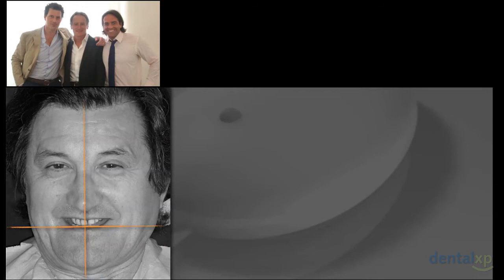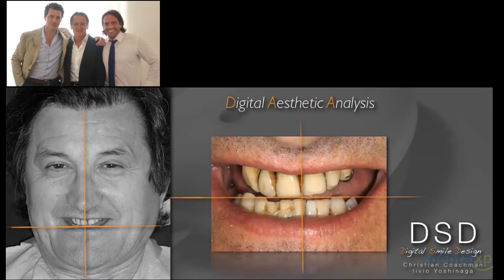So we see the same picture that we saw at the beginning, the facial analysis. We can see the midline, the occlusal plane, and we can evaluate it with this method that was introduced by Christian Coachman, the digital smile design. We can actually do a digital aesthetic analysis.